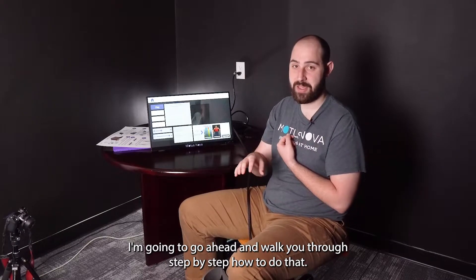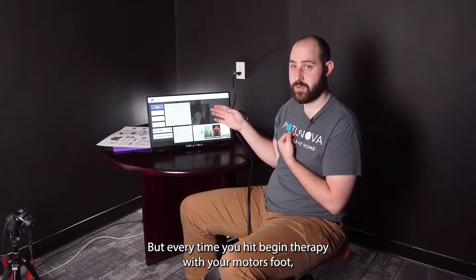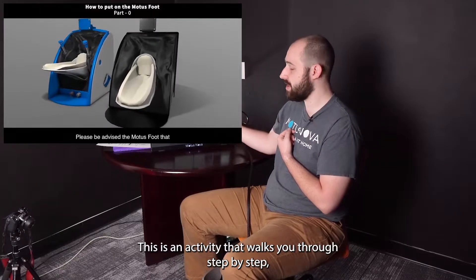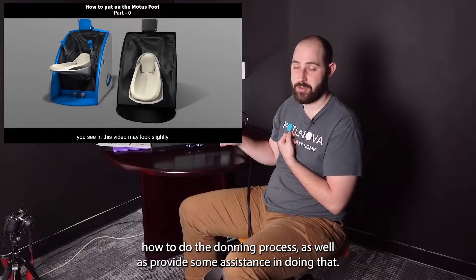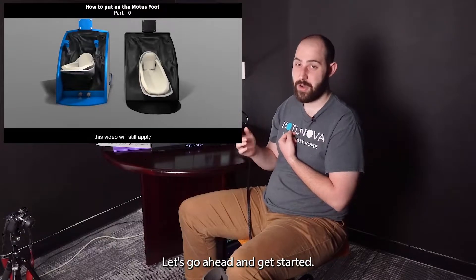I'm going to walk you through step by step how to do that. Every time you hit 'Begin Therapy' with your Motus Foot, you'll get to this screen here. This is an activity that walks you through step by step how to do the donning process as well as provide some assistance in doing that. Let's go ahead and get started.